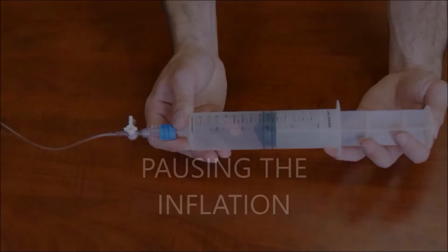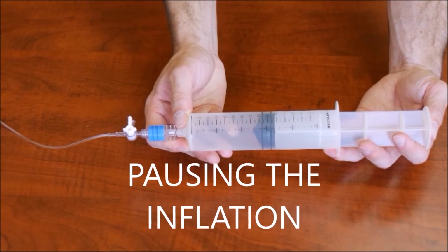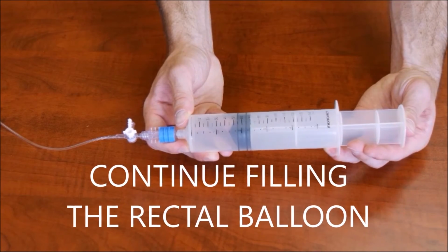When you have reached your desired level of inflation, make sure to utilize the off position of the flow control switch. This will prevent air pressure from pushing back on the syringe. To continue filling the balloon, simply switch the flow control switch to the on position.